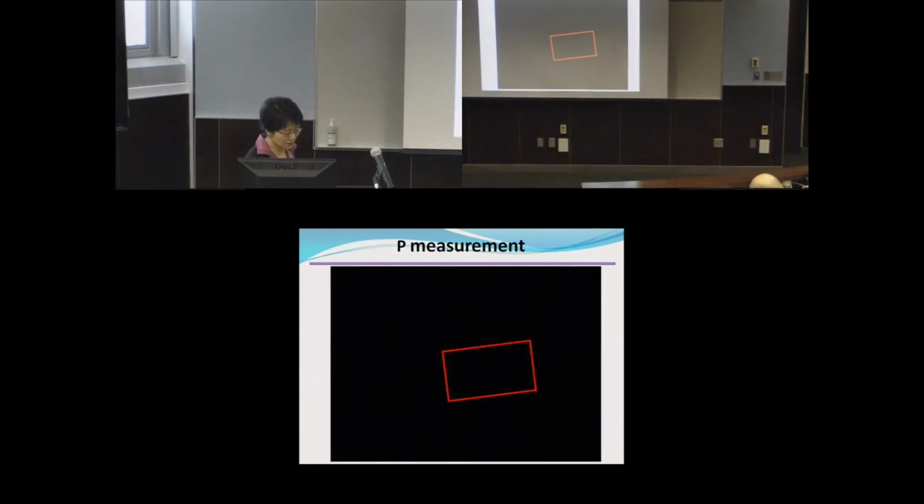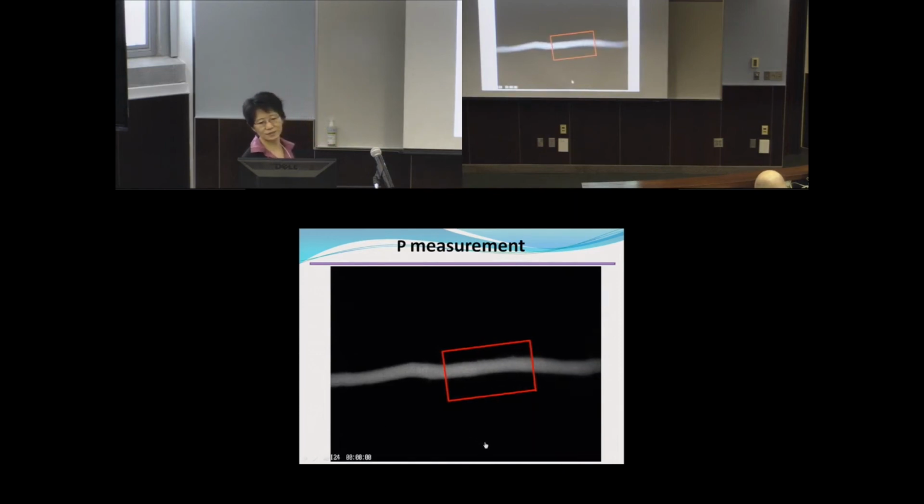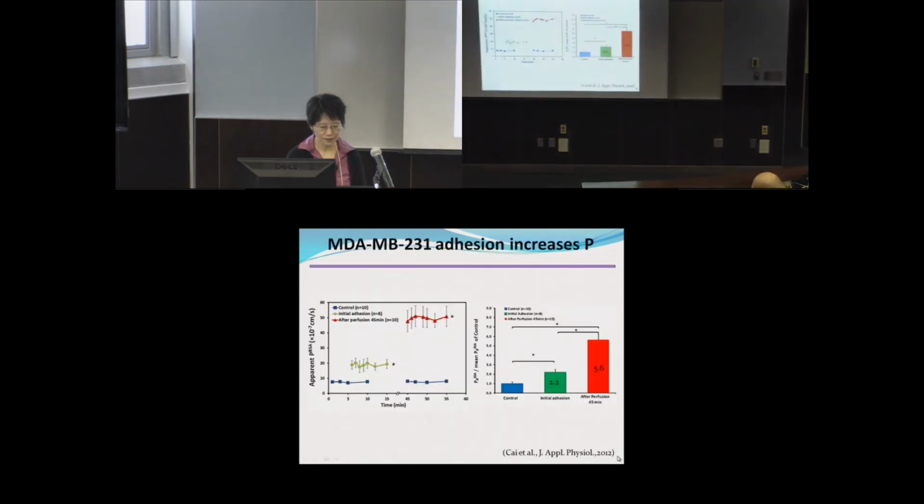Okay, then I show you another movie. So this is a measuring window, and then if we inject the dye, you see it, but you cannot see by your eyes the diffusion of the solute into the tissue space. Okay, wash out, and we can repeat the experiment. Okay, this is for solute permeability. This is for albumin permeability.